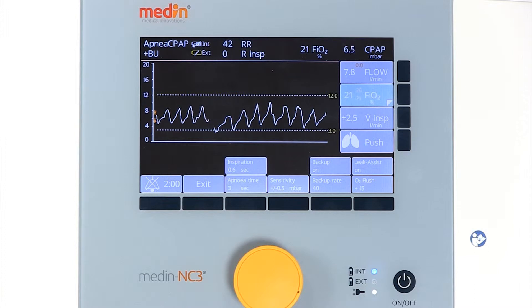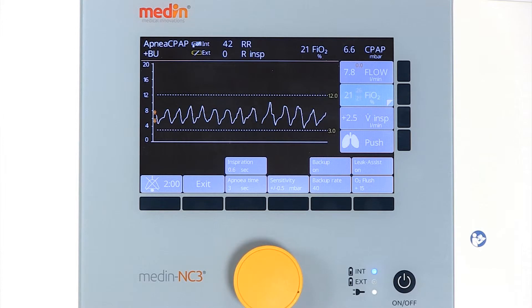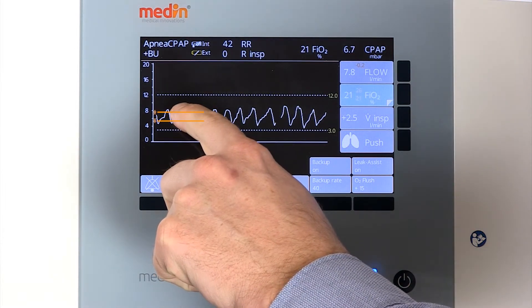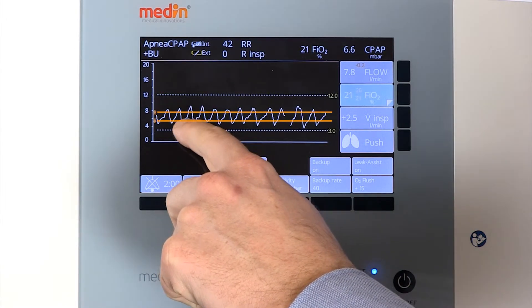The pressure trigger is set correctly when the pressure fluctuations during spontaneous breathing extend above and below the trigger thresholds, indicated by the orange arrows.